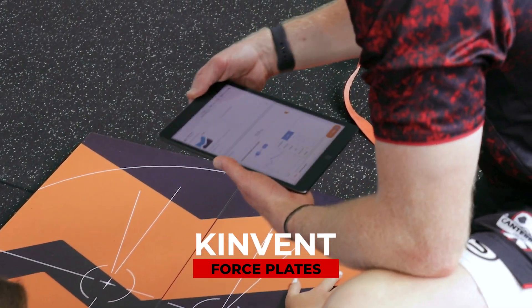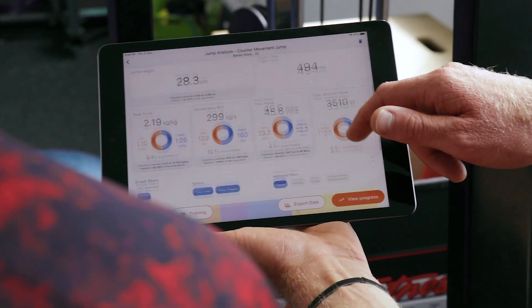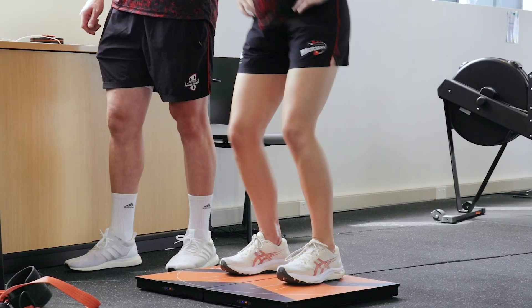We're pretty lucky here at Motus Health that we've got access to the Kinvent force plates — they're awesome. We use them a lot with our return to play, so it's great for looking at imbalances between limbs, whether legs or upper limb. We can do a variety of different tests on those plates.